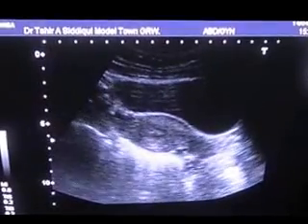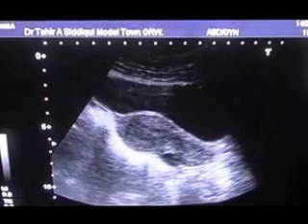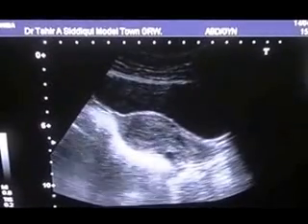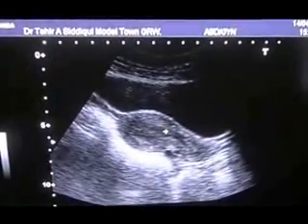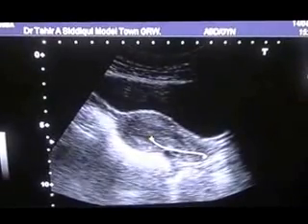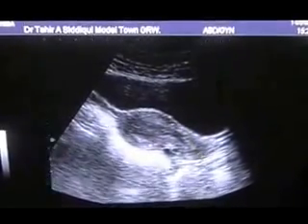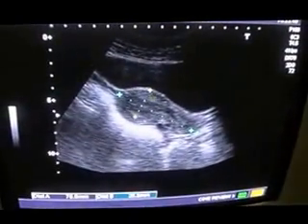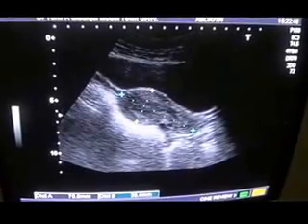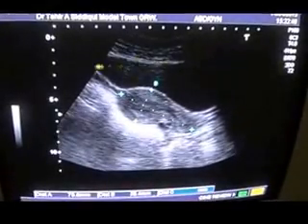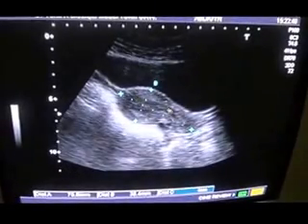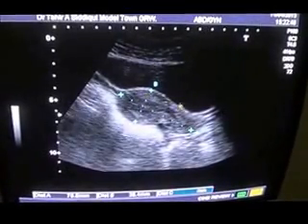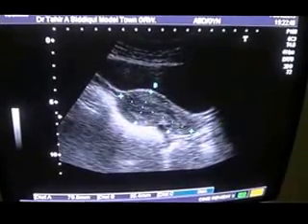17-year-old unmarried female with a history of pain in the right pelvic region for the last few years. We are seeing the uterus in longitudinal section. I have aligned the uterus with the vagina and it measures approximately 7.0 by 3.0 centimeters, which is within normal dimensions. This is the urinary bladder. The endometrial canal is clear, the myometrium is okay, and the cervix is normal.